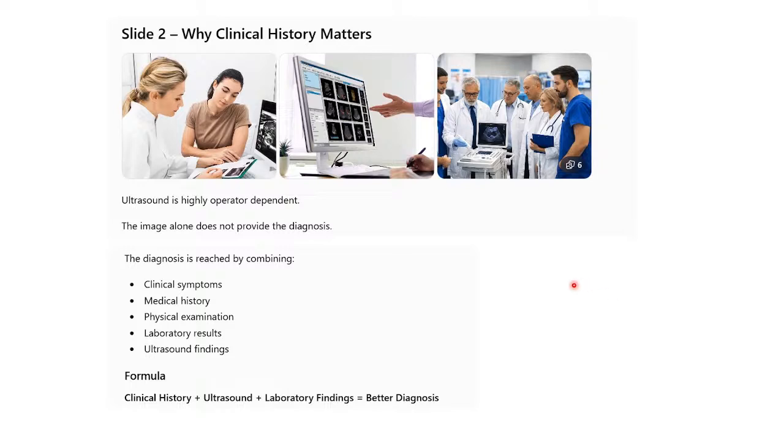Ultrasound is highly operator dependent. The image alone does not provide the diagnosis. The diagnosis is reached by combining the clinical symptoms, the medical history, the physical examination, laboratory results, and the ultrasound findings. So the formula that we use is clinical history plus ultrasound plus laboratory findings is equal to better diagnosis. This is an equation, a formula that you must master: clinical history plus ultrasound plus laboratory findings is equivalent to the final diagnosis.